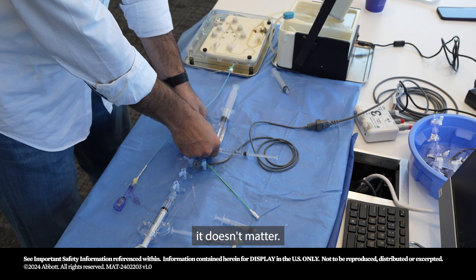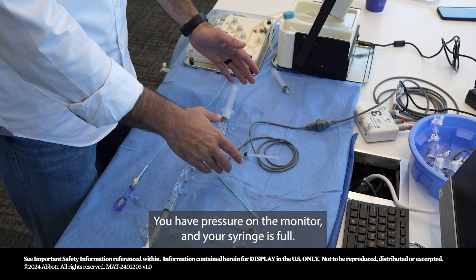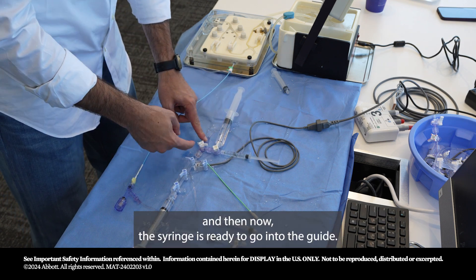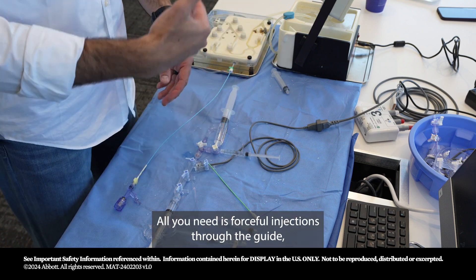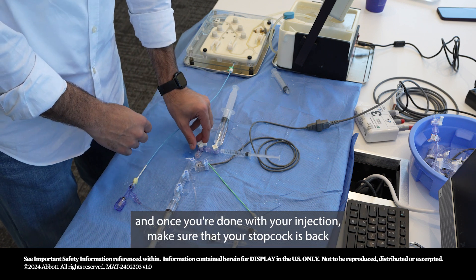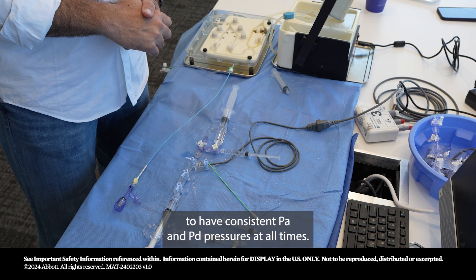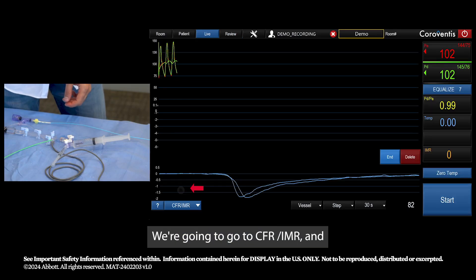Once hooked up, you have pressure on the monitor and your syringe is full. The motion is: fill the syringe, then it's ready to inject into the guide. Turn the stopcock to the patient and inject. Once done with your injection, make sure the stopcock is back to transducing aortic pressure — it's very important to have consistent PA and PD pressures at all times. Let's go live for CFR and IMR.